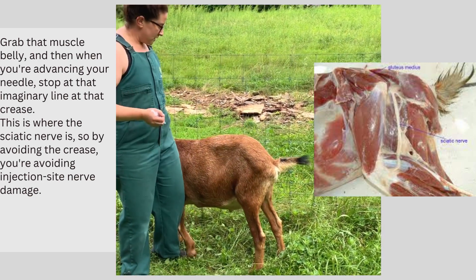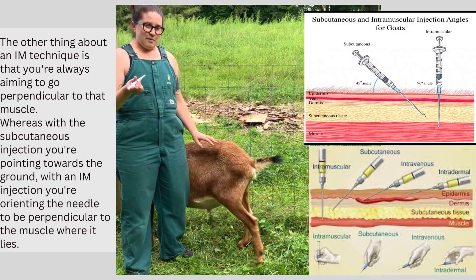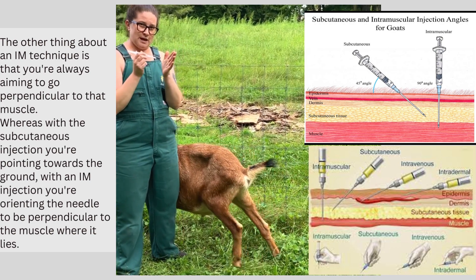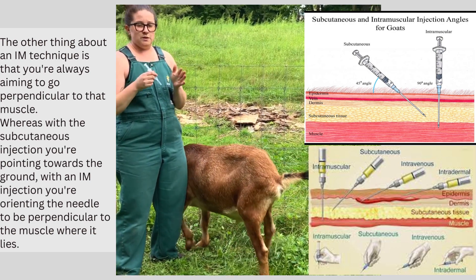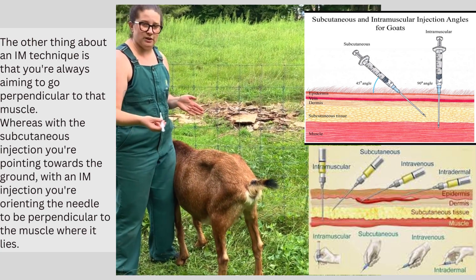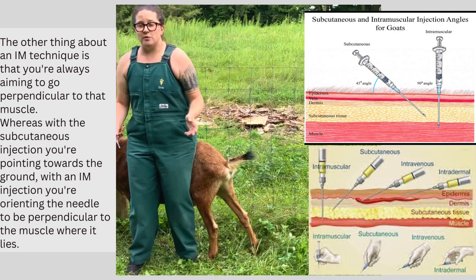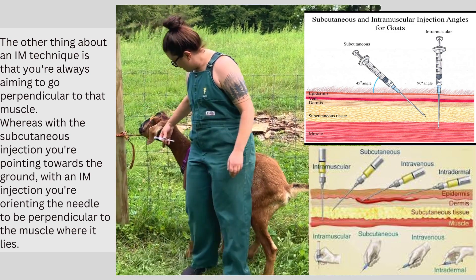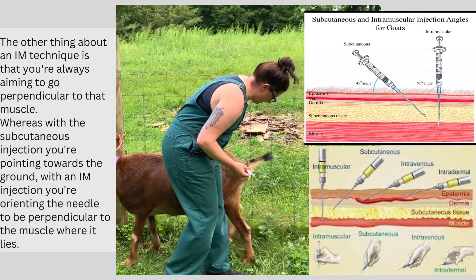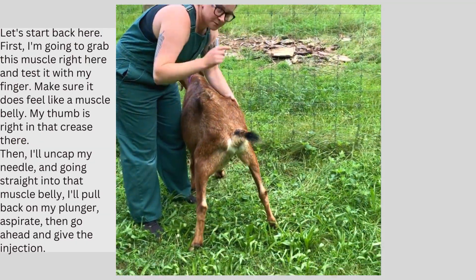So let's go ahead and start with the gluteal injection. The other thing about an intramuscular technique is you're always aiming to go perpendicular to that muscle. Whereas with a sub-Q injection you're pointing straight at the ground, in this case you're moving perpendicularly towards that gluteal muscle like this, or in the situation with the neck injection, you're going to go straight in like this.